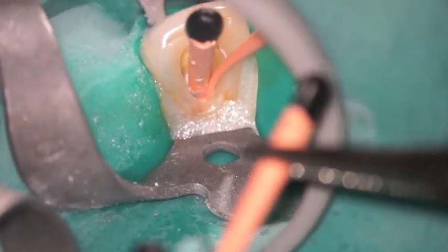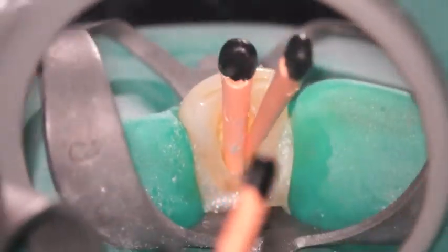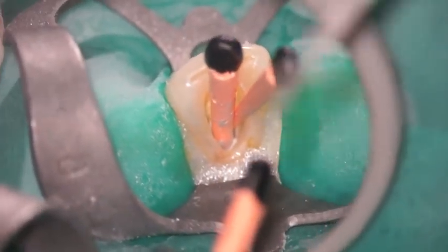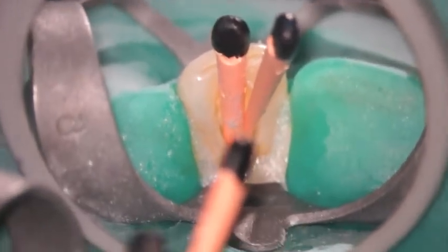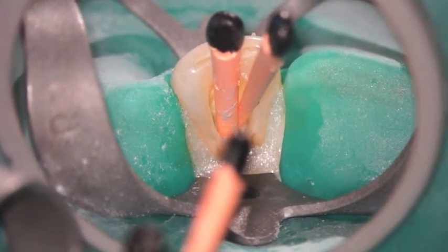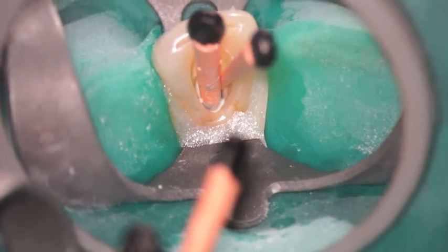I like to place the sealer cone first and then place my master cone. In this particular case, because of the size of this tooth — I believe it's a number 10 or number 7, something like that — it's a very large root canal system, an anterior tooth. So I've placed more than one gutta percha cone in there so that when I sear it off, I'm capturing more rubber as I condense it vertically.